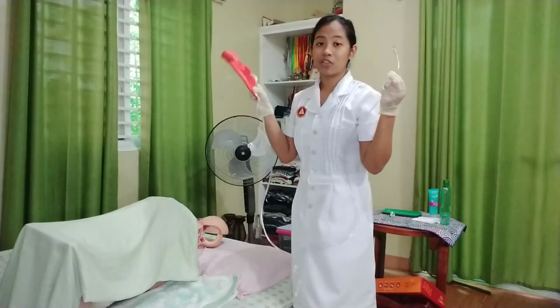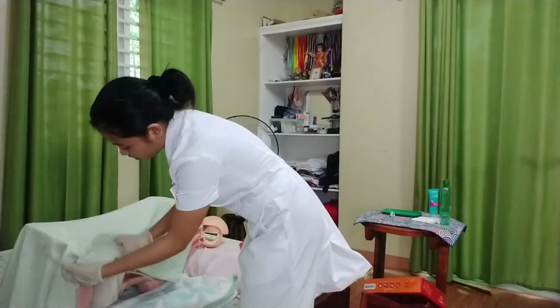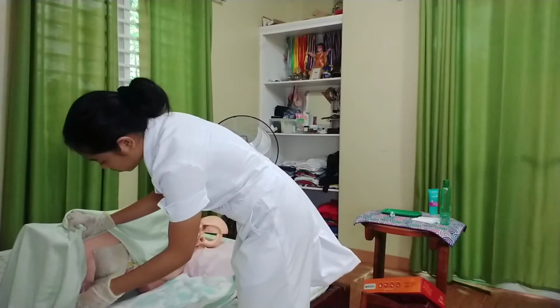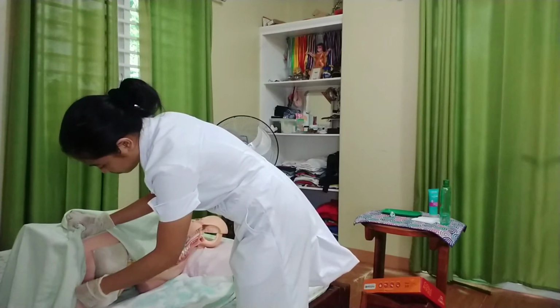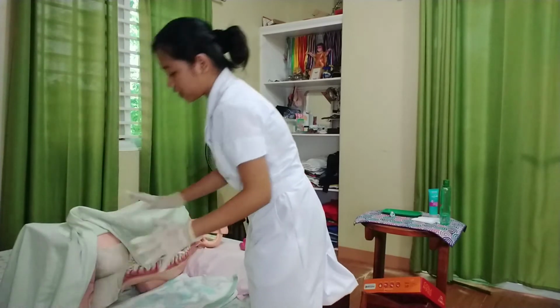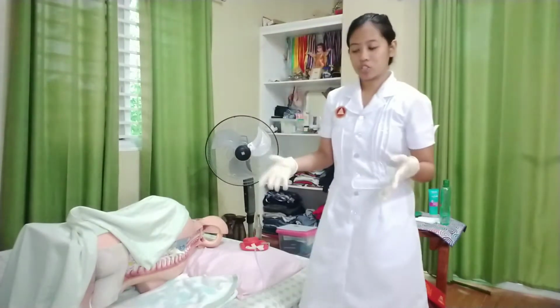So assuming that this is the solution container, I will administer the tube now, ma'am, okay? So 1, 2, 3, 3 to 4 inches. And then after that, I will now administer the enema solution slowly.